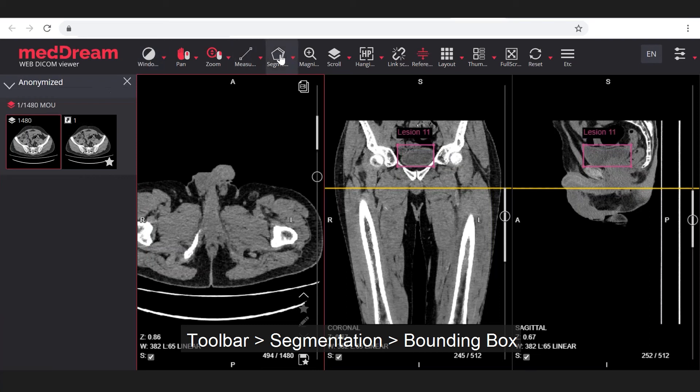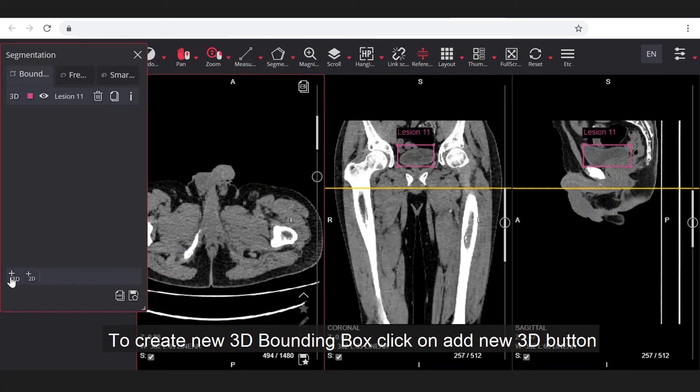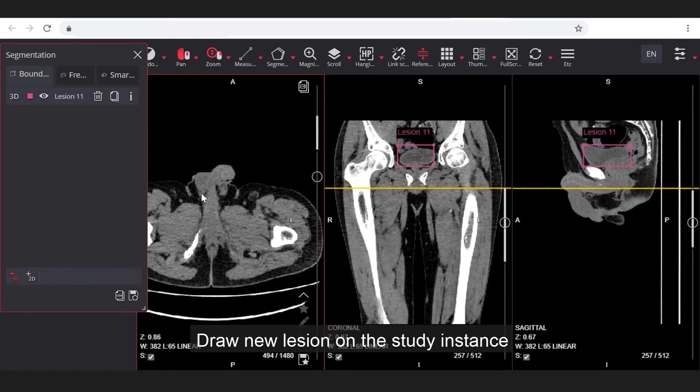Open segmentation menu from toolbar. Click on add new 3D bounding box button. Draw new lesion on the study instance.